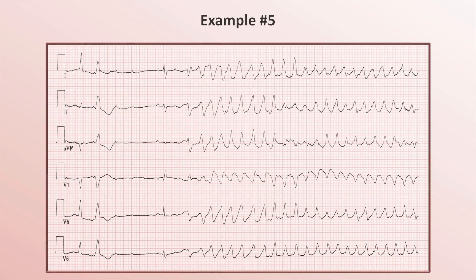Example 5. You may immediately notice that this strip has two distinctly separate rhythm issues. The first third is a bradyarrhythmia, but we are going to focus on just the other two-thirds.